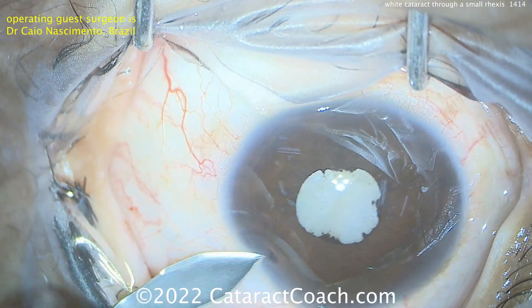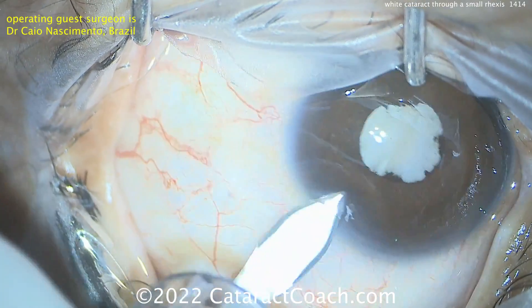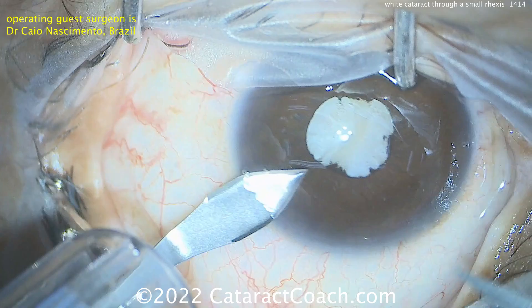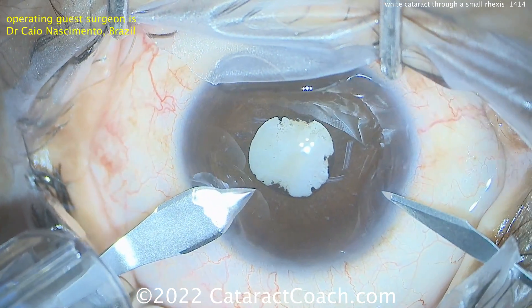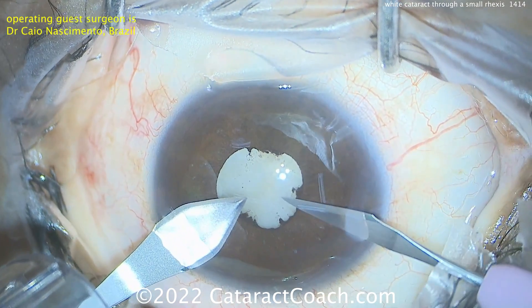Some posterior synechiae there. Here's that Brazilian method of doing two incisions at the same time — getting that keratome in and holding the eye with it while using the side port blade to make the paracentesis. So there are your two incisions that are made.